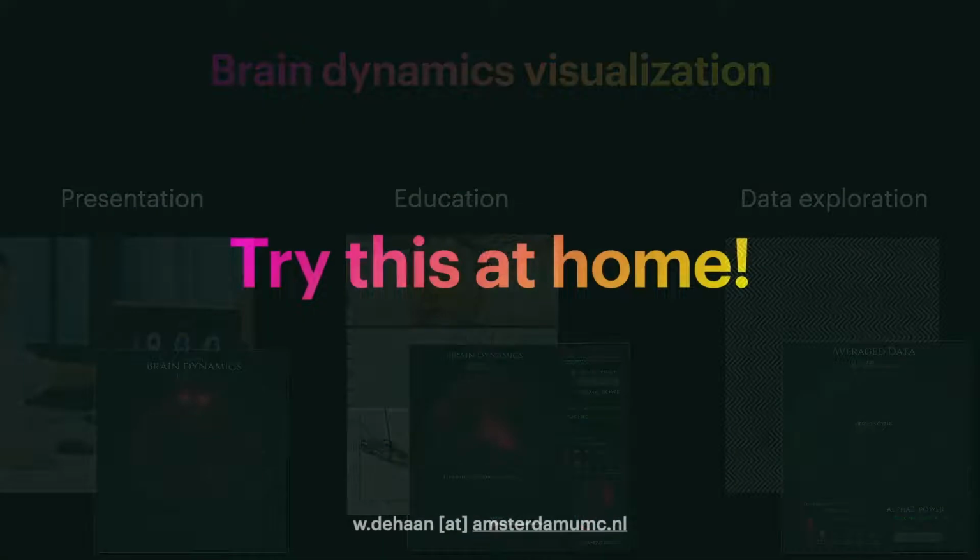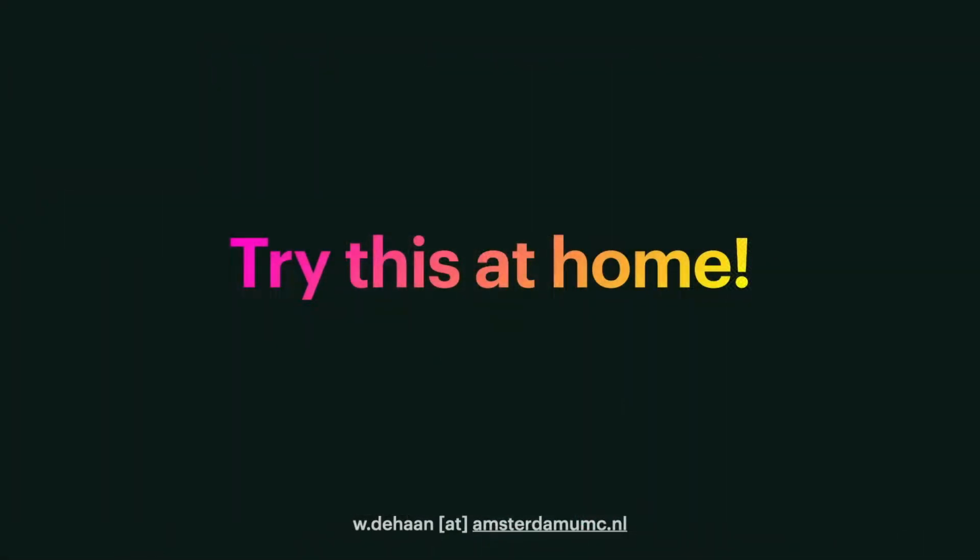We hope to have our program freely available online this year, but my real take-home message is, try this at home. There are no costs involved, except a fairly modern computer, but hey, you have that already. And okay, you do need some brain data, enough time and a lot of patience, but with that you can make your data look like a Hollywood movie and help us EEG scientists become the rock stars of the 21st century. Thank you.